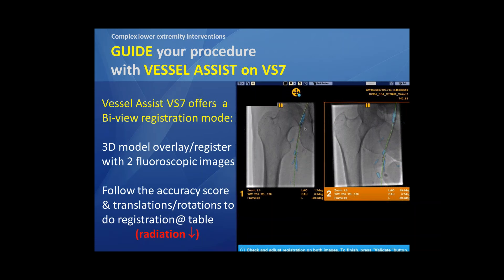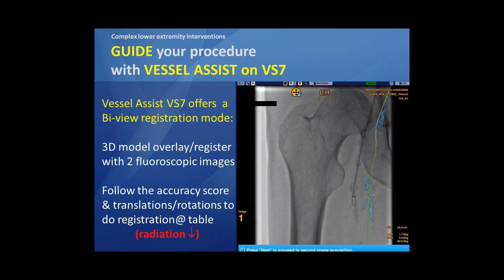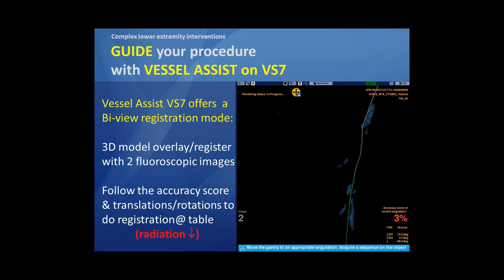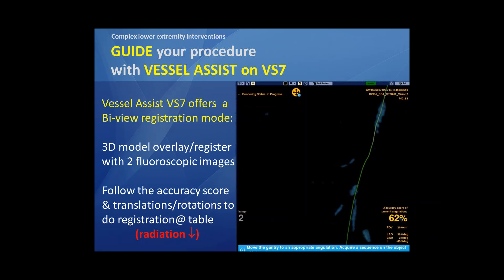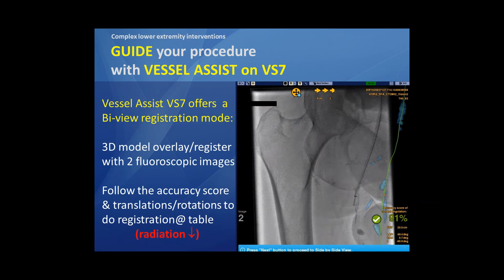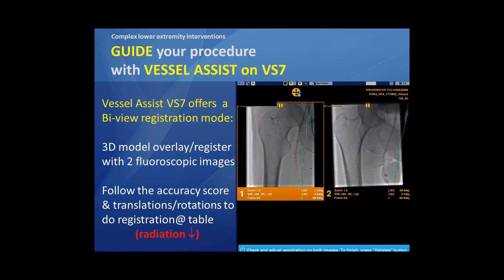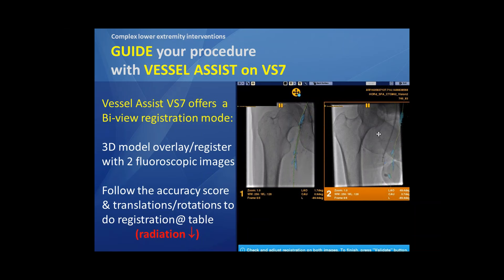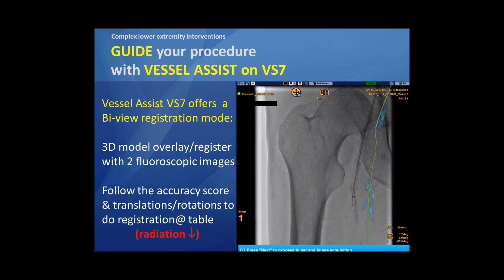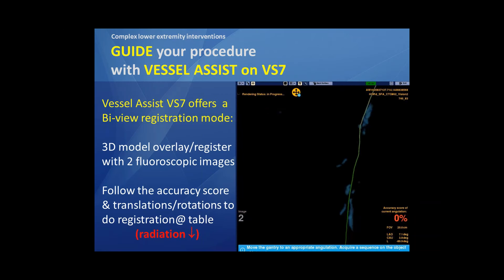Just based on calcifications and some bony landmarks — in this case there was already a sheath from a crossover axis in place — and using the accuracy score, we can rotate and translate our two fluoroscopic images in a perfect way on the table in order to have a very accurate 2D/3D fusion.